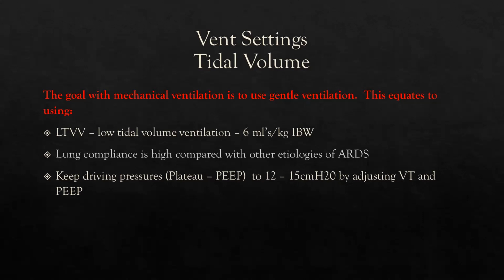So if we reduce the tidal volume to deliver a smaller tidal volume, give more gentle ventilation, what's going to happen to the CO2 in the blood? If you're giving a smaller tidal volume, what do you have to do in addition? Very good. Did you get that, Chris?